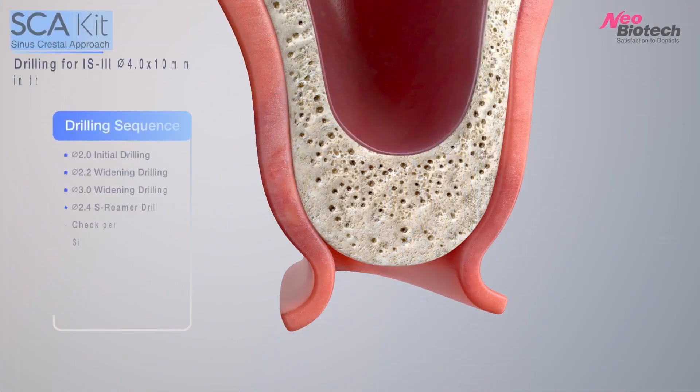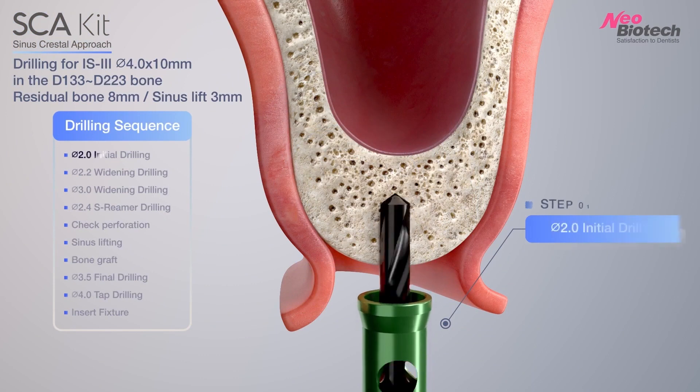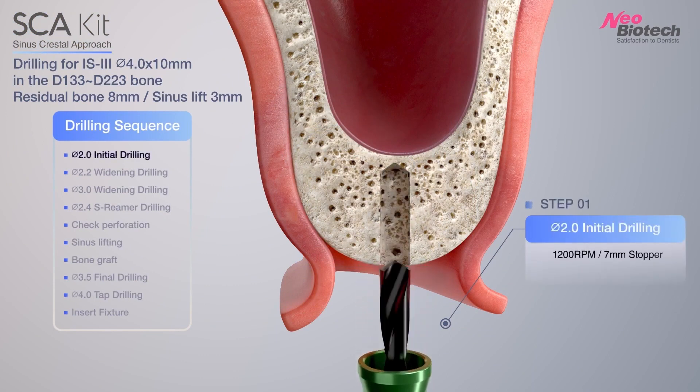SCA kit is Crestal Approach kit for sinus lift since 2008. First, using 2.0 initial drill with stopper in SCA kit.